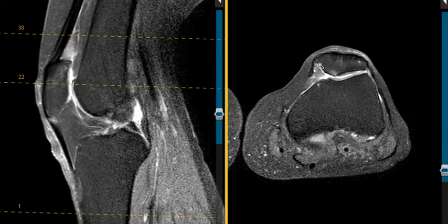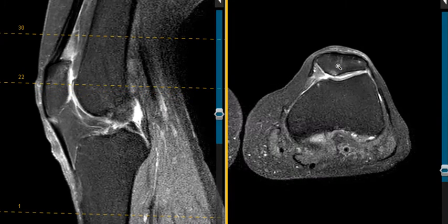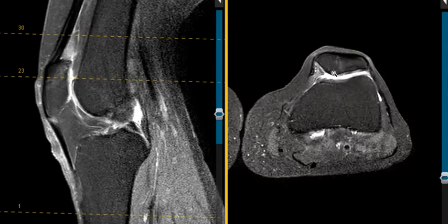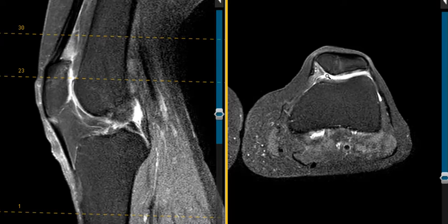This is an axial view. We see the kneecap here sitting right on top of the femur, which is right here. The kneecap is nicely aligned. There's no abnormal subluxation or tilt of the kneecap. Looks good. But we can see here the little bit of brightness beneath the cortical bone. The cortex is a black line, and there's a little bit of brightness underneath. That's where we have the bone erosion, a little cortical erosion and subchondral marrow edema.